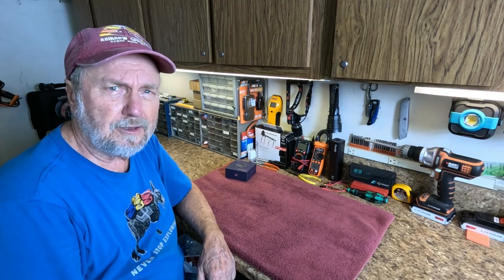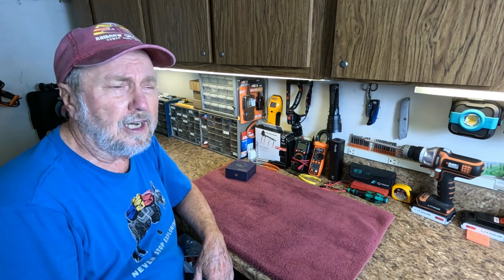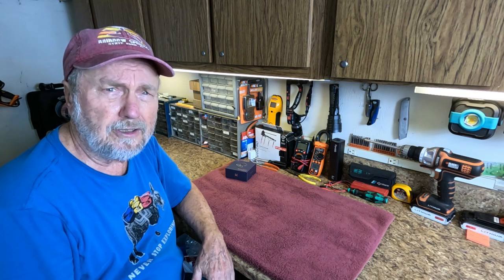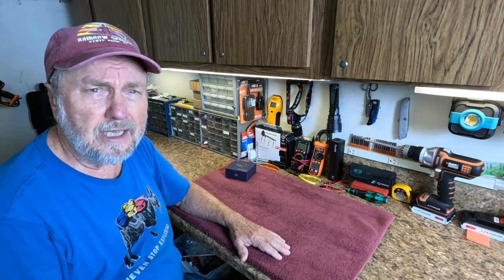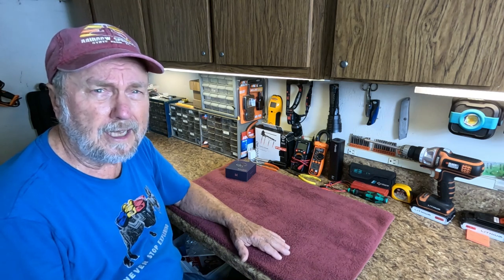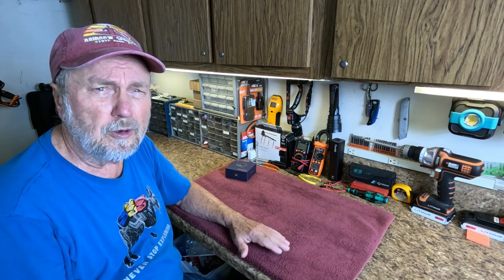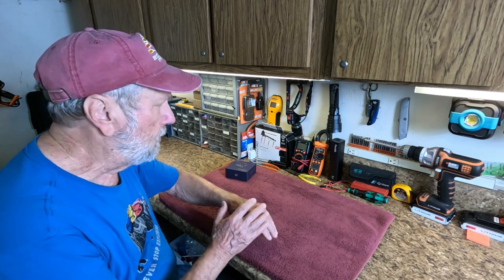Hello folks, Sam Owens here with a product I feel is directed towards seniors or anyone with mild to moderate hearing difficulties. This might be the answer for those times when you just don't hear every word or you miss some things. Let me show you this product.